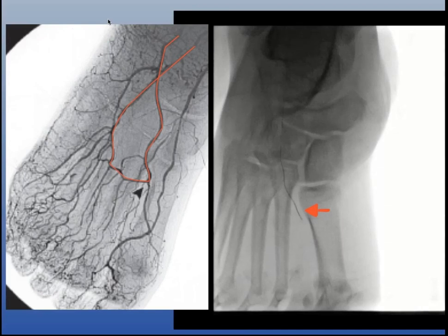So again, to remind you, I have a catheter and a CTO wire with a low gram tip load, and you can see where it prolapses at that red arrow between the base of the first and second metatarsal. That's the classic location for that first bend or turn into the perforating artery, the deep perforating or communicating artery. Then at the base of the third should be my next turn to get into the lateral plantar artery, and there it is in this case. Whether it's the base of the third or a little bit farther depends on your obliquity. So the more AP your foot, the better.